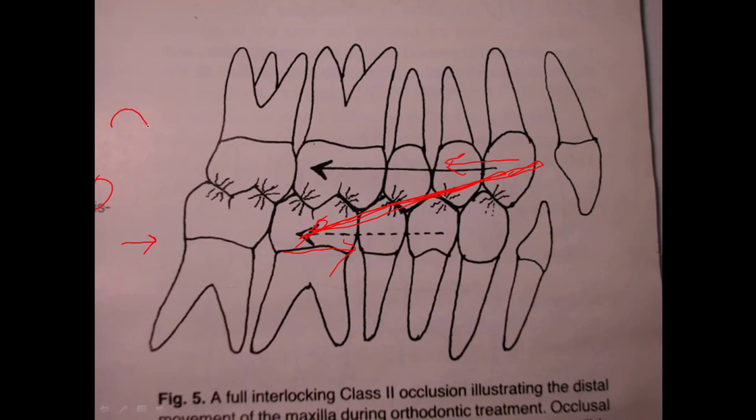and it gets the condyle sitting up in here, and if you move it forward a little bit, that's fine. But if you push it backward, it gets back here on that retrodiscal tissue, and it starts bothering somebody who's very tender in this area, in the ears back in here. So this is the condyle, coming up like that. And if you pull it forward, that helps most of them. And I thought, well, this Class 2 elastic is pulling this jaw forward, and it should be helping this. And I'm pushing back on this to actually bring this forward. I beat my head against a rock trying to figure out how to do it.